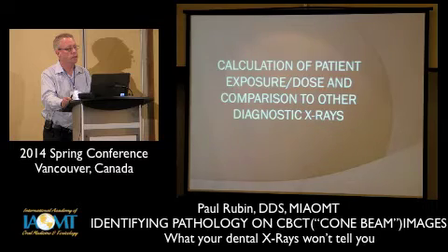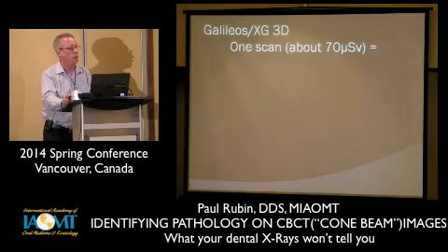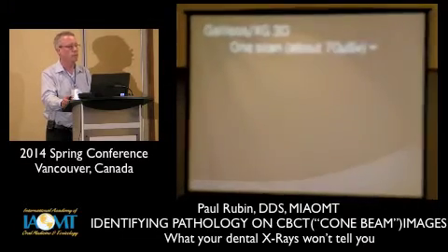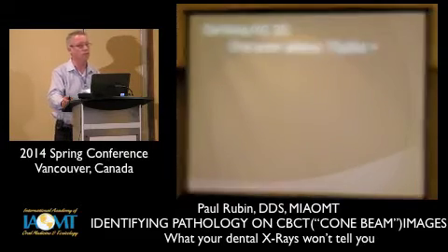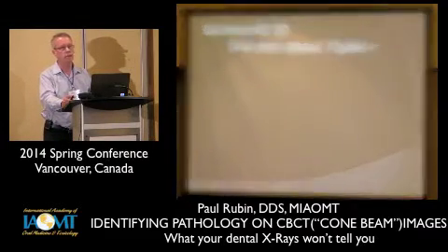Dosage is measured in microsieverts, and the best way to get a sense of what a cone beam exposure is like is to compare it to other x-ray imaging. In our office, I practice in the space with Dr. Mitch Martyr. I think you're back there. This is his unit. It's a Galileos by Sirona.